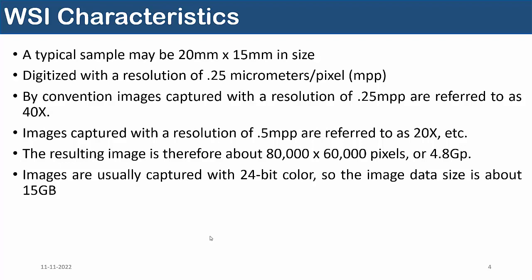Assume the resulting image is about 80,000 by 60,000 pixels. That is around 4.8 gigapixels. If it is represented in RGB, with a 24-bit color channel, the image size would be approximately 15 GB.